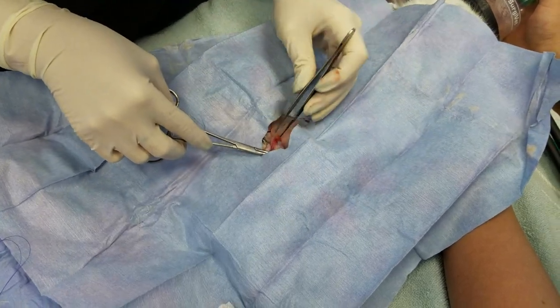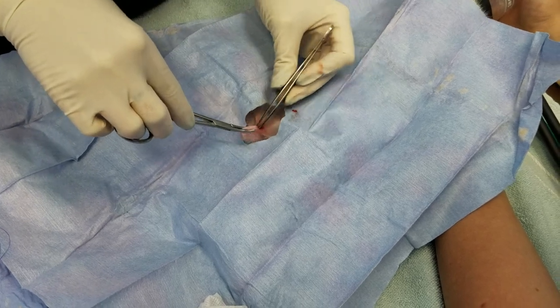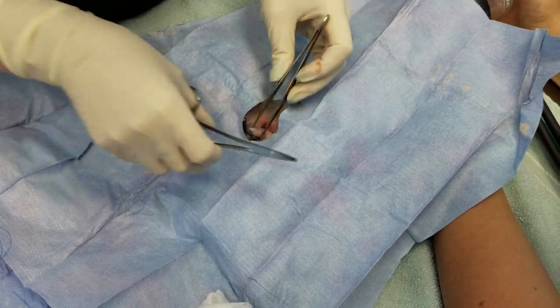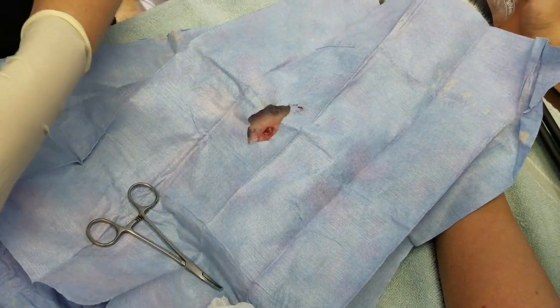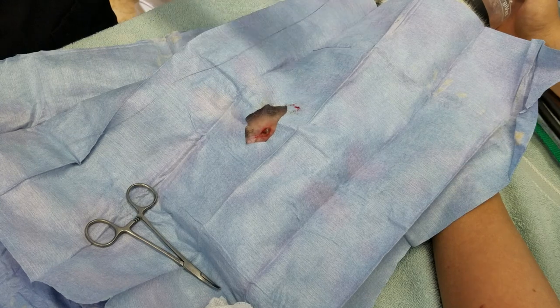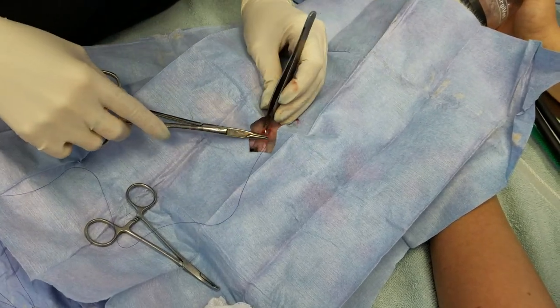So we're going to check for bleeding, which there is none. Replace our scrotum. And then we're going to close. So these guys, I try to just keep everything intradermal so they don't have anything to chew on.